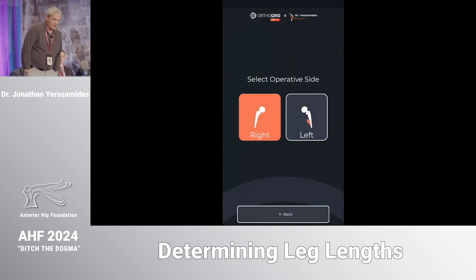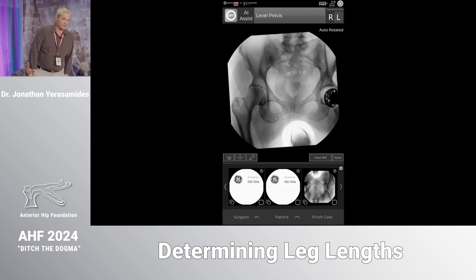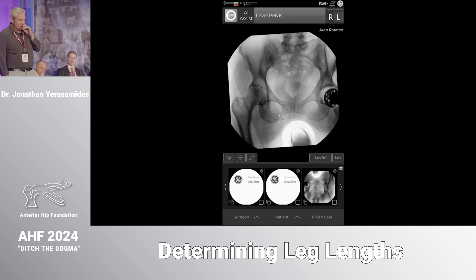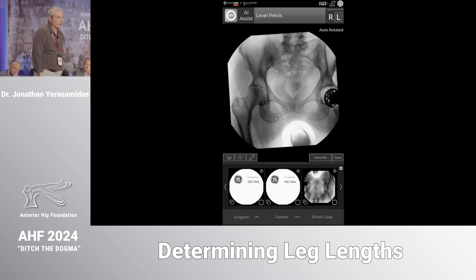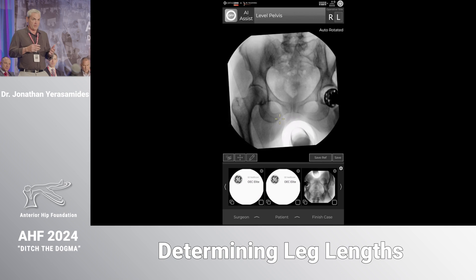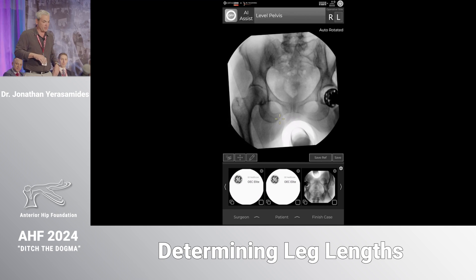I'm going to run through a quick case because there are some important things regarding the femur, length, and offset that you need to be aware of. Just because your machine says 43/23 doesn't necessarily mean the cup is an actual 43/23. The first and most critical portion is to have a level pelvis before you start.